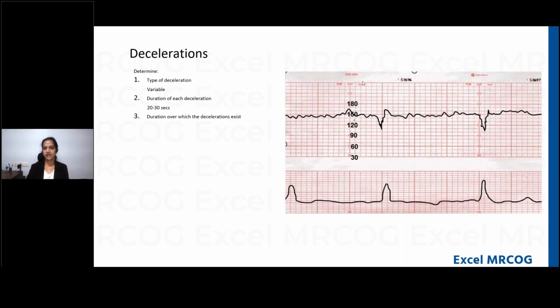See, you can see my cursor, right? It's important that you see it. Now you can see this is the point. So this will be 1 centimeter, this will be the second one, so 2 centimeter, and this will be third. So 3 centimeter. So you can say the distance from this line to this line is 3 centimeter. I mean, sorry, is 1 minute. Yeah, 3 centimeter is 1 minute.